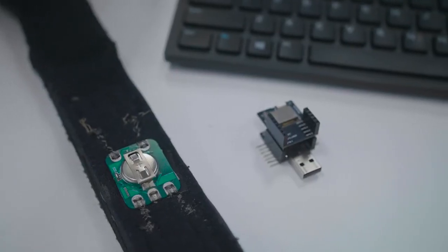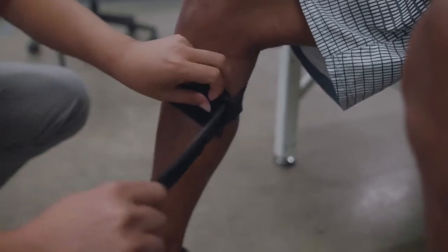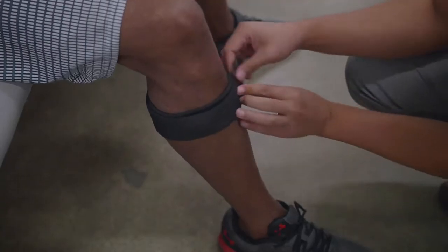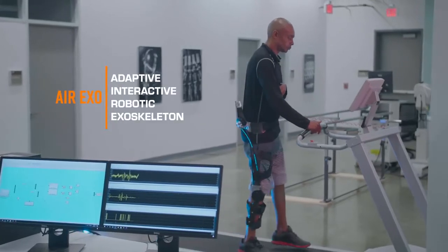This soft exoskeleton also has a soft EMG sensor that can help adjust the resistance to allow a person to vary how much effort is going to be exerted.